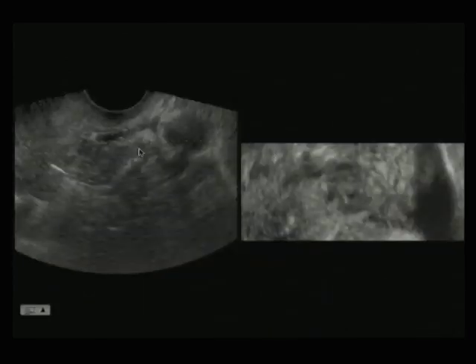Now here is an ovary right in here, hard to see, but when we do the coronal plane in this area, in the postmenopausal ovary, you will identify it perhaps a little better. Here is the ovary here with a thick slice technique. The ovary, I think, may be better seen in the coronal view.